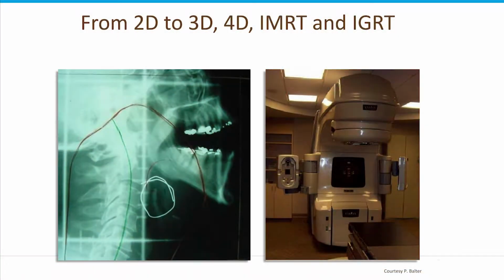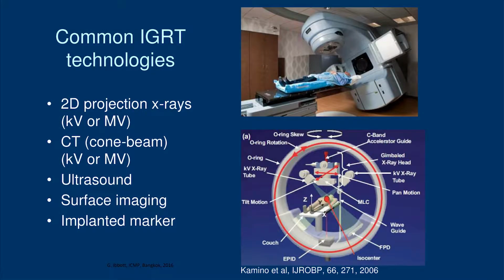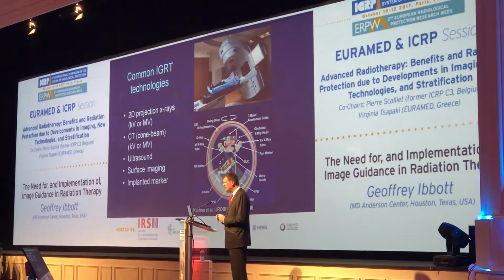Now, our equipment has improved. Here on the right is a picture of a modern LINAC with what we call onboard imaging to take those same sort of X-ray images for image guidance. And here's a couple more pictures. Again, a modern accelerator with an onboard X-ray imaging system. In the lower picture, a similar device. I don't believe this system is actually available anymore, but it also allowed image guidance using X-ray tubes mounted in a circular gantry, so that again, the patient could be imaged by orthogonal X-ray beams, and the position of the patient verified or adjusted if necessary.